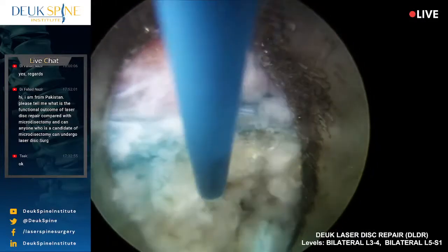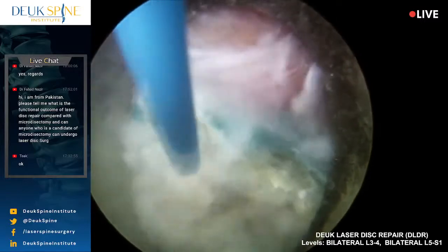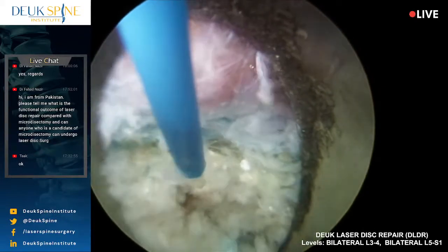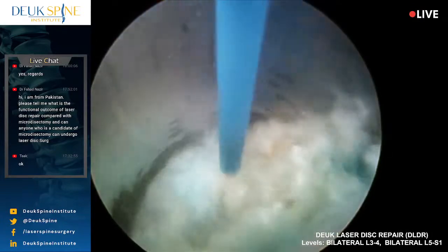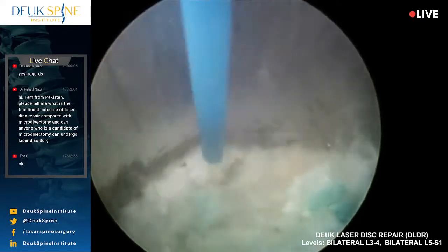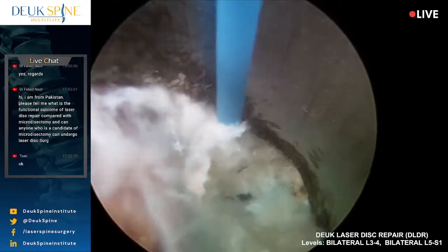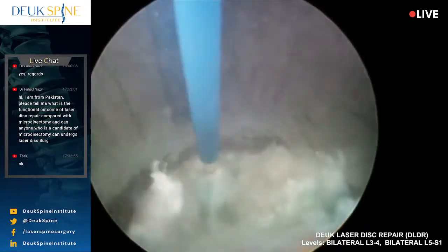It's a big old vein right there. See it? Grab her.